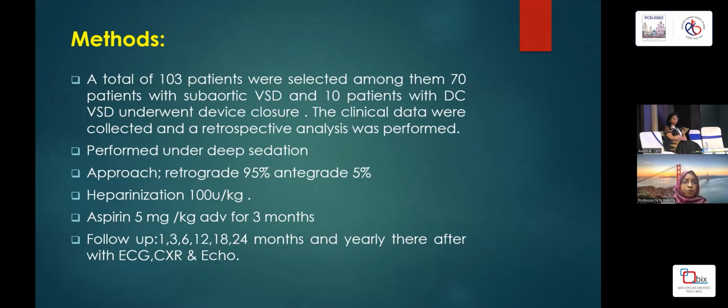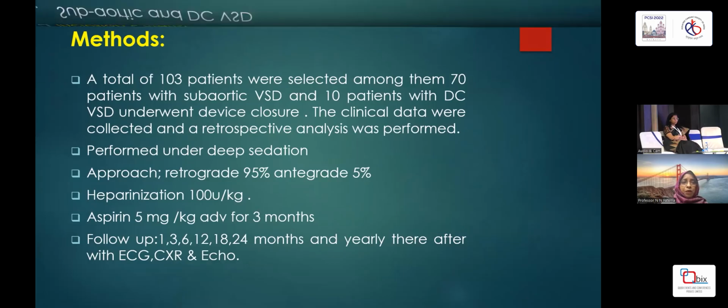The procedure was performed under deep sedation. The approach was retrograde in most of the cases, in 95%. Heparinization was done fully. Aspirin was given after the procedure for 3 months. We have not given it for 6 months, only for 3 months, but there was no problem.